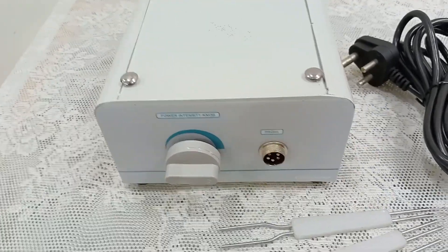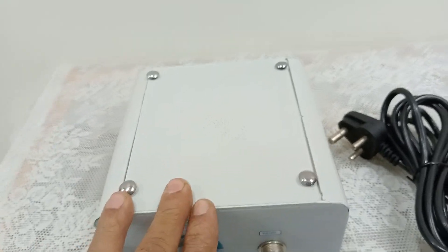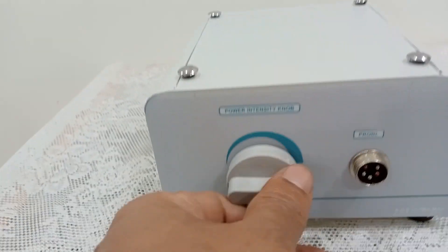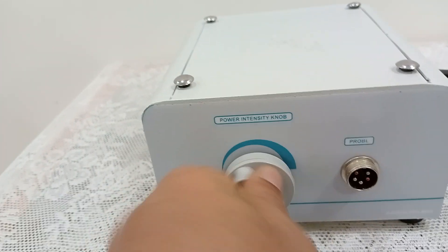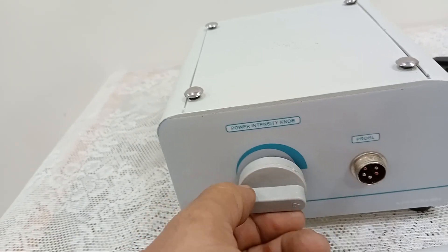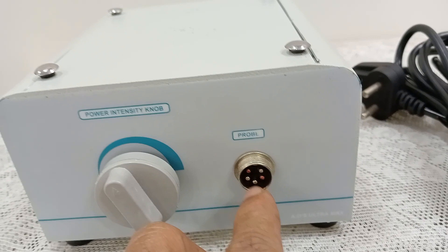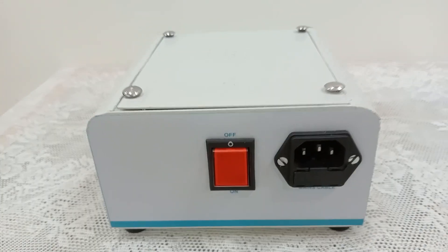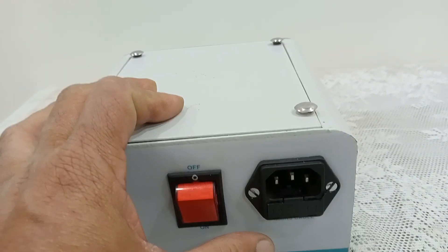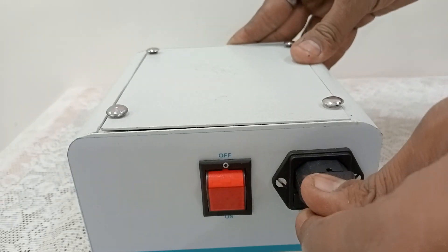The machine is built into a metal body with a high quality heat-resistant coating. There is an intensity power knob with settings 1, 2, and 3. Here you have to connect the probe. At the back of the machine there is an on/off switch, and here you have to insert the mains cord into the port.